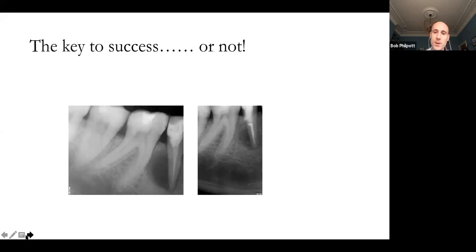What I didn't realize was that there was some kind of tooth colored, I don't know if it was a post or some kind of restorative material, right down to this level. And so accessing with an ultrasonic, which will be a lesson to me, I went completely off angle, created a perforation coronally, redid the root canal treatment, kept it dressed for a long period of time. But you can see the healing is really, really good after 6 months.